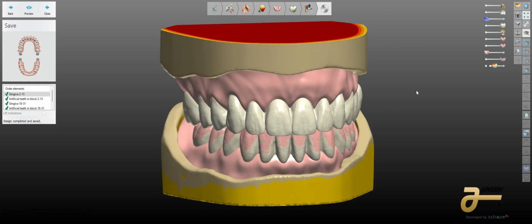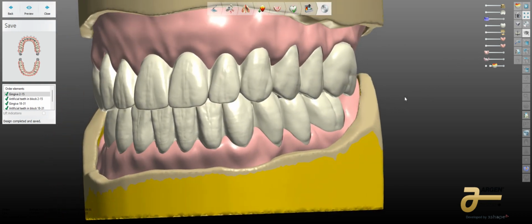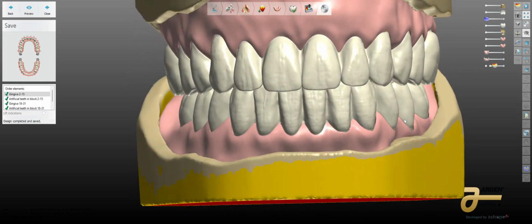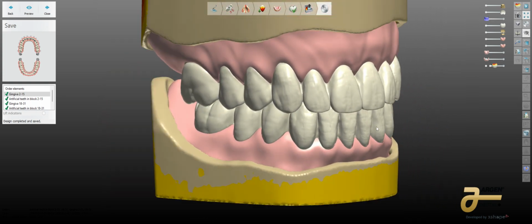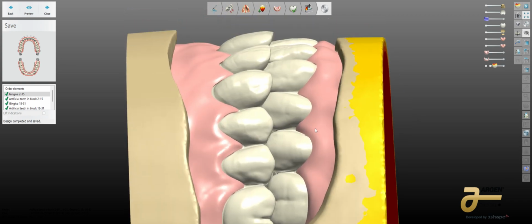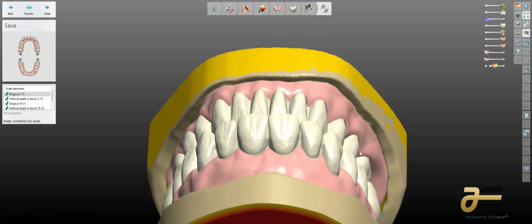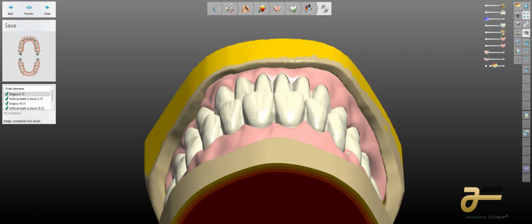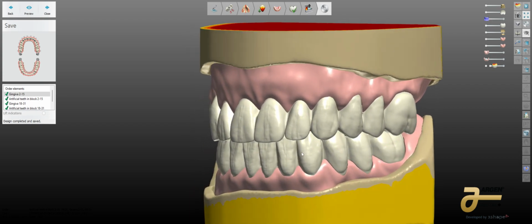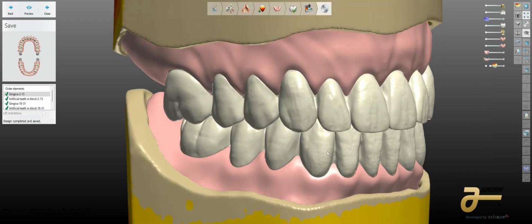And again, it's been my pleasure to share a little bit of my passion with you. You know, dentures have been a telling part of my career, and it's a real reason why I am so comfortable with All-on-X. And you can see some of the contour shapes and information that I've been able to provide in this little bit of time. And hopefully I will get some good feedback for this little video, and you'll enjoy me doing more of these.